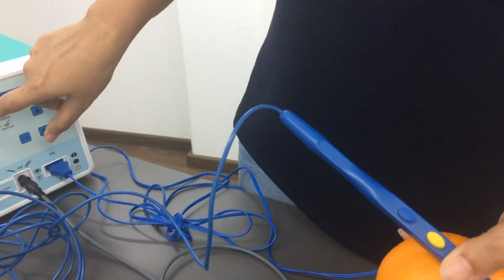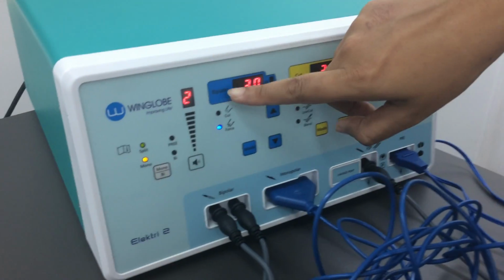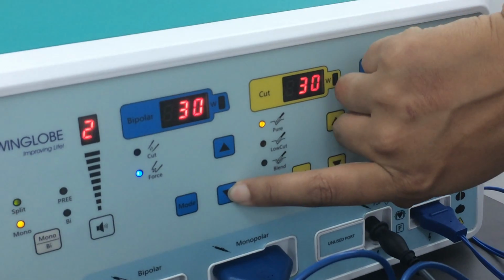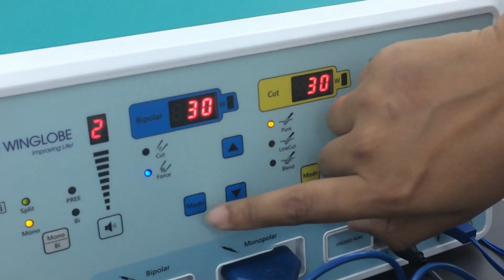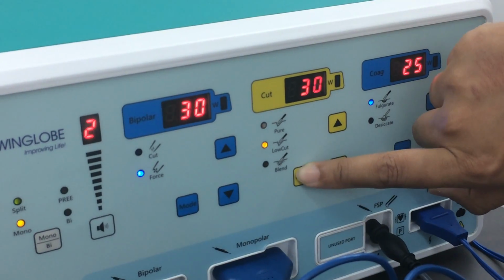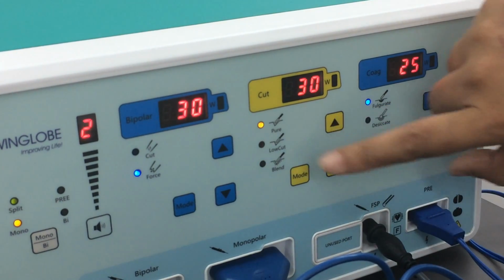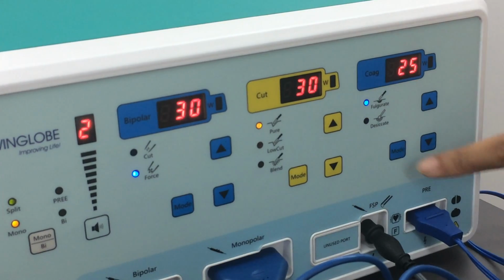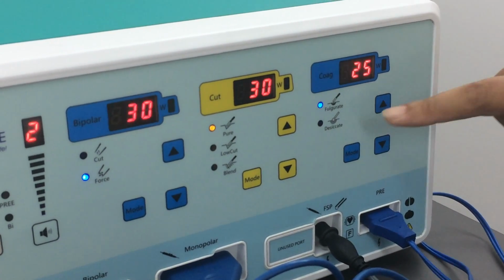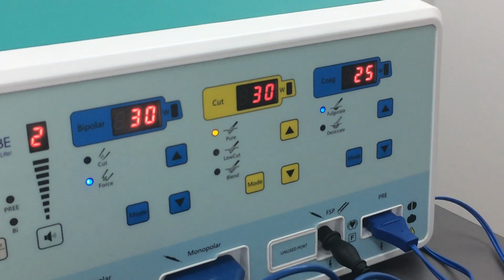If you can just look at the screen, the bipolar is set at 30 watt. I can change the power settings with the up and down arrow and the mode using the mode button. The same goes for monopolar cut. I have set it at pure cut, 30 watt, and coagulation also can be changed using the mode button, which I have set at 25.